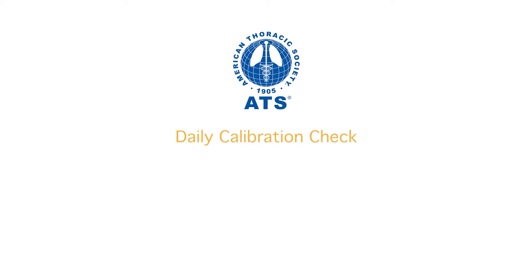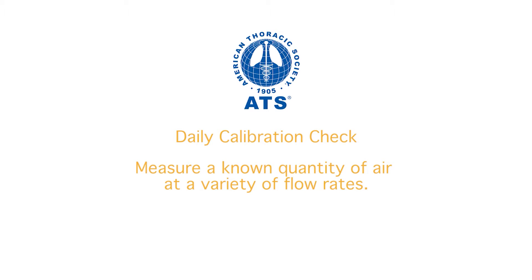The American Thoracic Society recommends that a calibration check be done daily before using the spirometer. The purpose of doing a calibration check is to verify that the spirometer can measure a known quantity of air at a variety of flow rates.